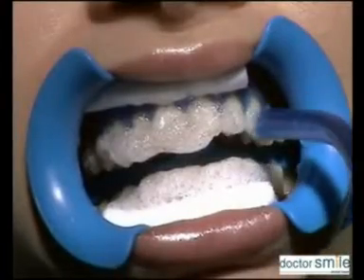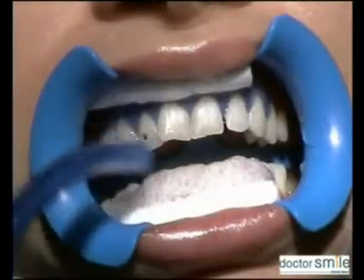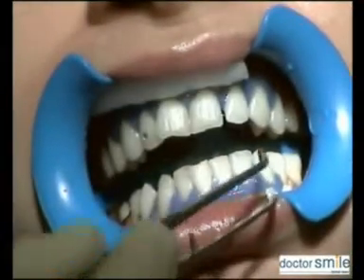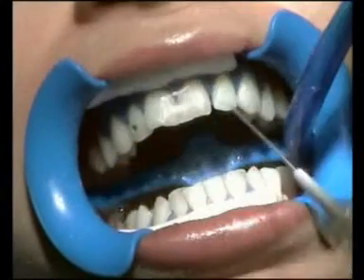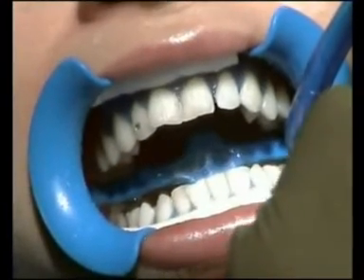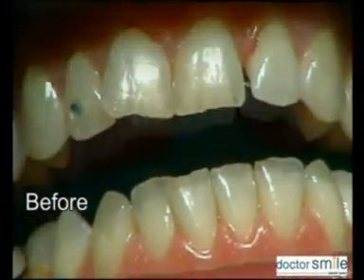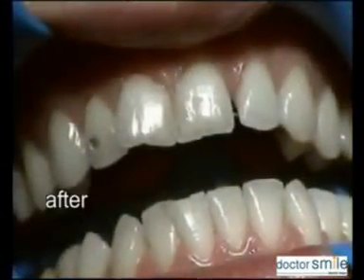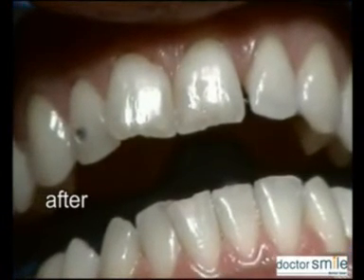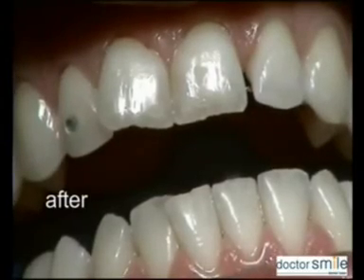Wipe off the gel by suction and remove the isolate dam with pincer. Rinse carefully from debris. Determine the new color grading of the patient and advise the patient to avoid staining with liquid beverages and food.